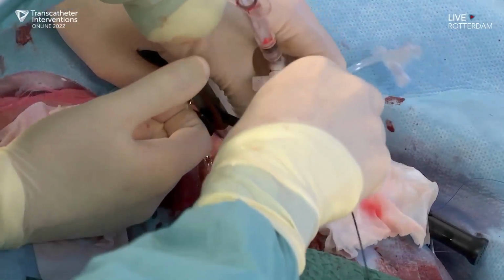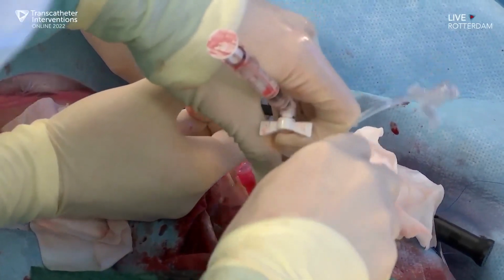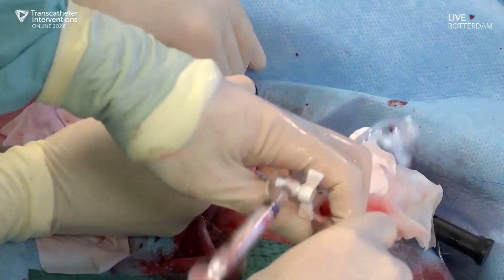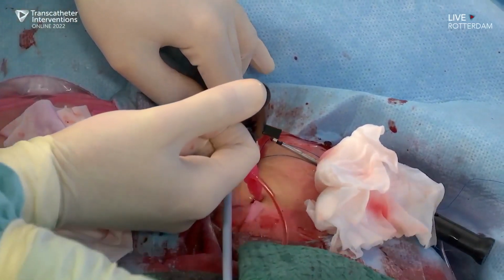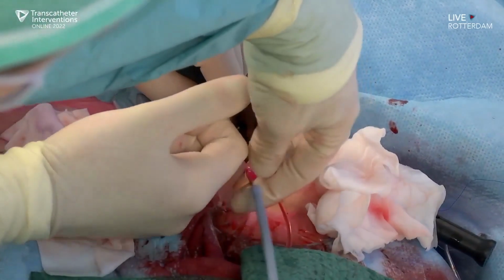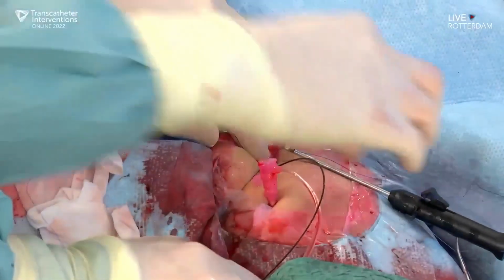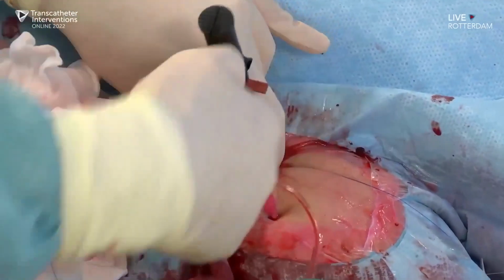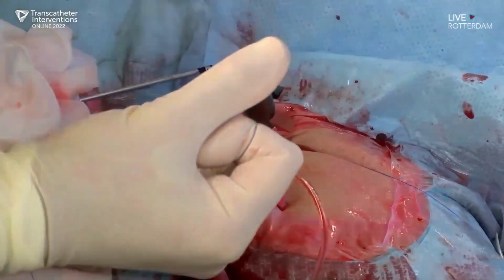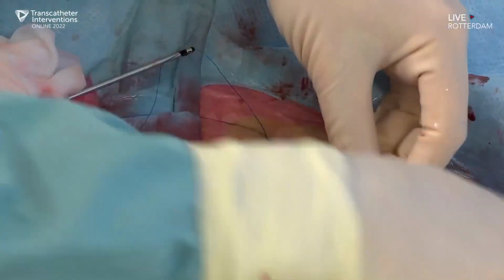And this dry seal sheath is such a sweetheart. So we used 4 of these sutures. 2 were torn apart during the pre-closure. So there is always a chance that you will tear another one as you are closing the pre-closure, obviously. So we're cognizant about that. But this looks very good. So I think this is immediate closure.